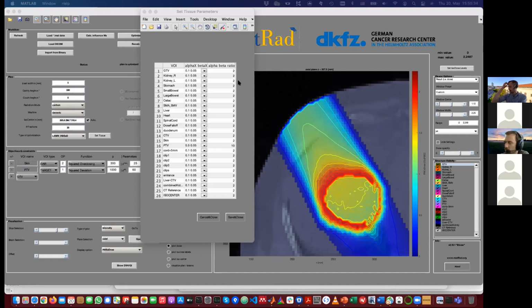All right, then I think we're slowly reaching the end of the hands-on sessions. Maybe a quick recap. On the first day, we did a quite extensive session on how to install matRad as a standalone or how to use it together with MATLAB.